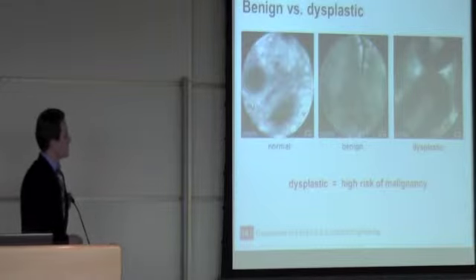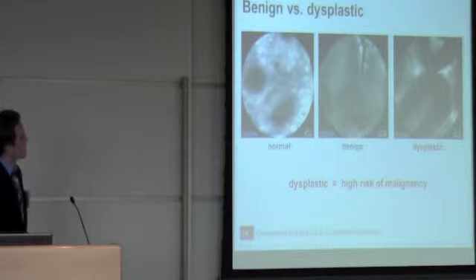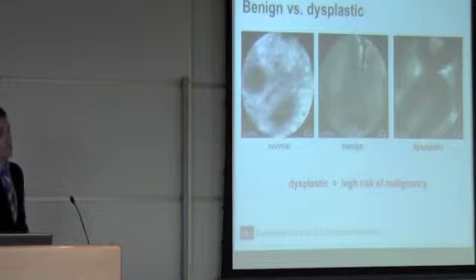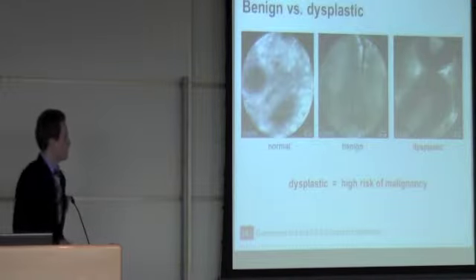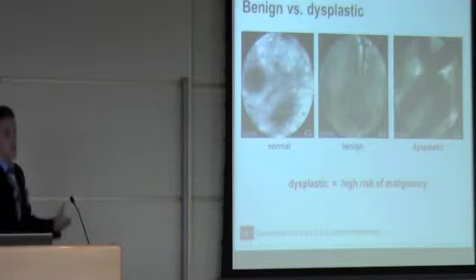On the left here is an example of normal colonic tissue. So once again, characterized by regular crypts, these circular objects, and they also have this point-like appearing lumen in the middle, the center. Now notice when we go to benign tissue, these objects right here, those dark lines, those are crypts, but they have changed, and the lumen becomes kind of star-shaped.